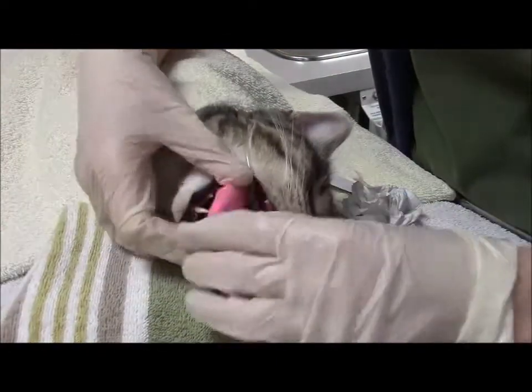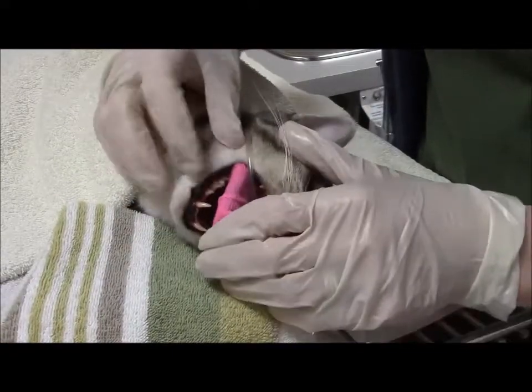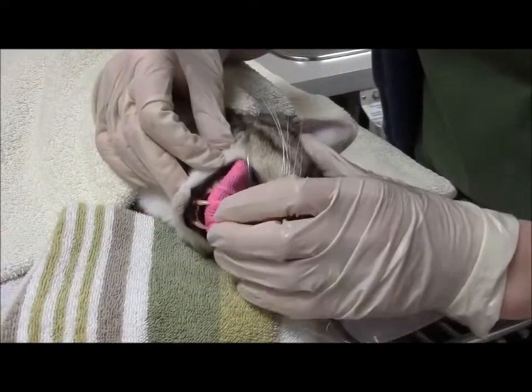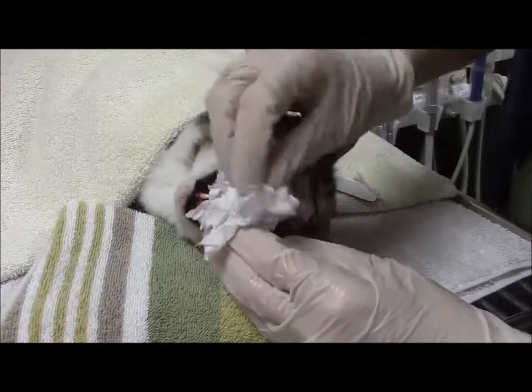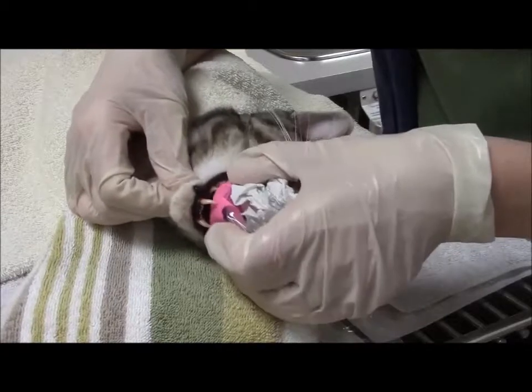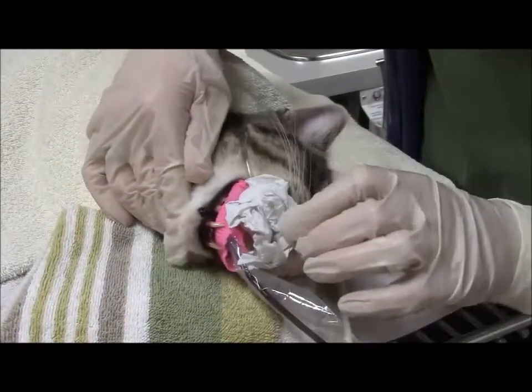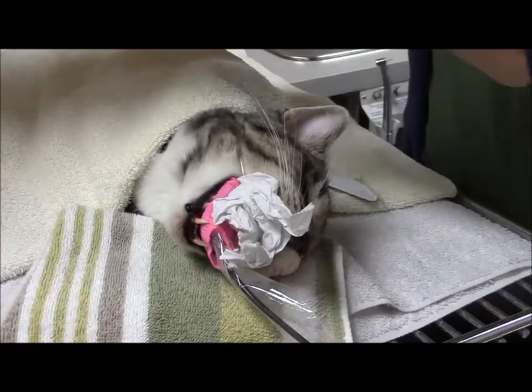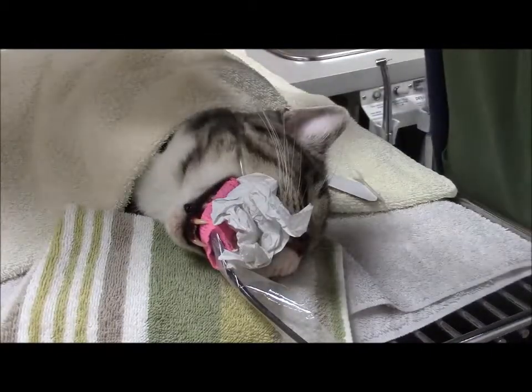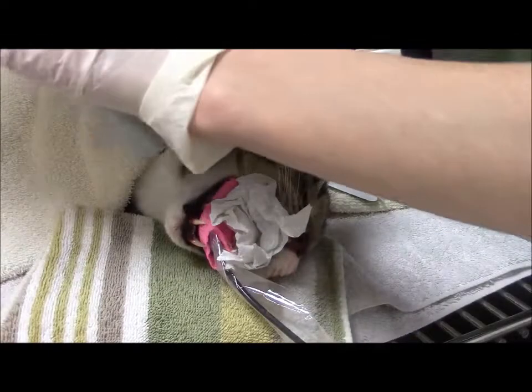So with a bisecting angle technique, if you push the sensor in back far enough, you'll be able to image all three of those teeth without any issue. So let's get the sensor organized for that one. Okay, so you're just going to put it flat as far back in the mouth as you can, like that. Your cone is going to come from the side, so again, make sure you position it so it's going to go dead onto that arcade.